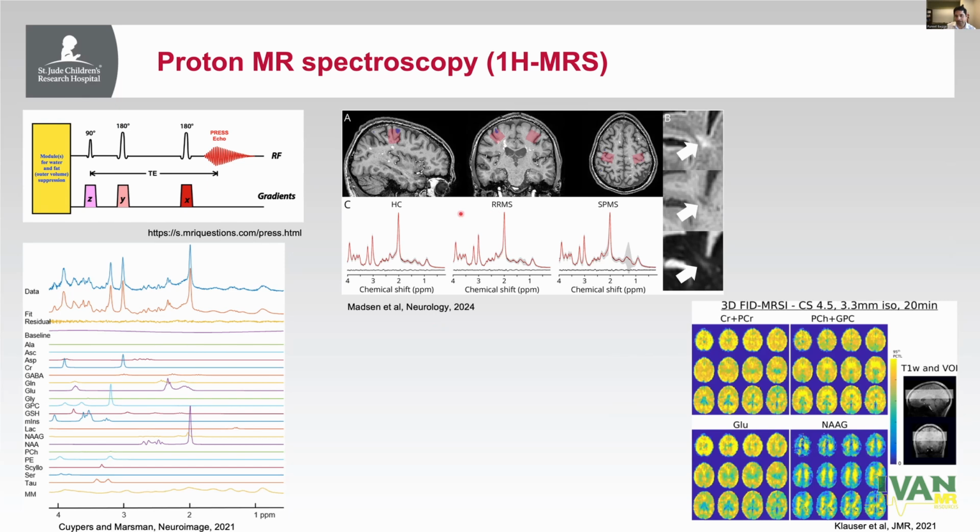So there's a recent article showing a very nice study showing early signs of decay in multiple sclerosis, I'm sorry. And it comes apparently much earlier than the apparent anatomical damage to the brain. So there are many studies. So spectroscopy is catching on. People are also really interested in doing 2D MR spectroscopy, 3D MR spectroscopy with a very high resolution, getting all the metabolite maps and so on.